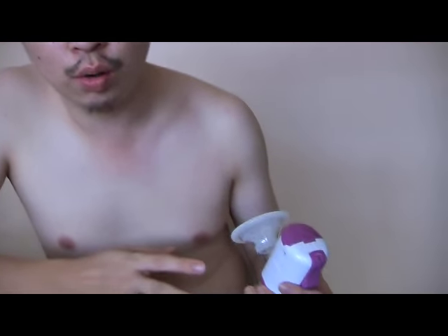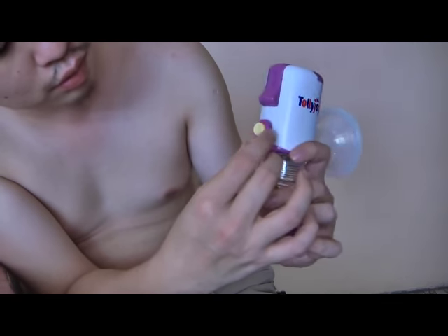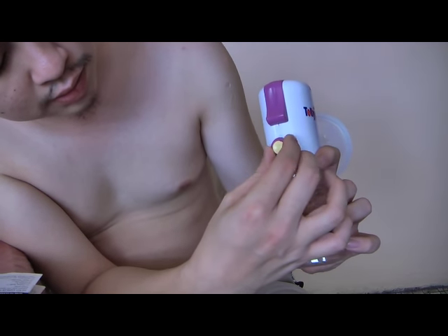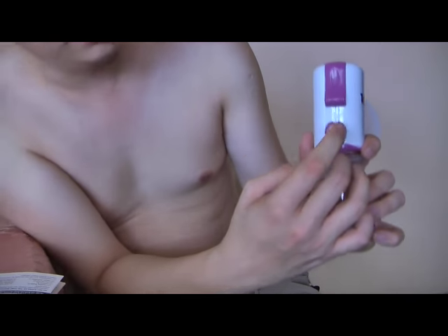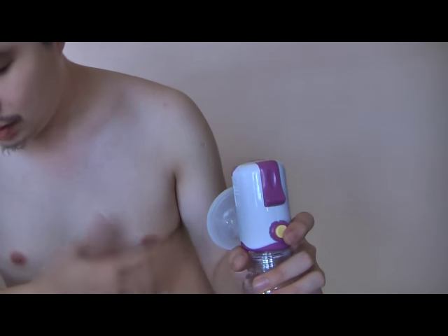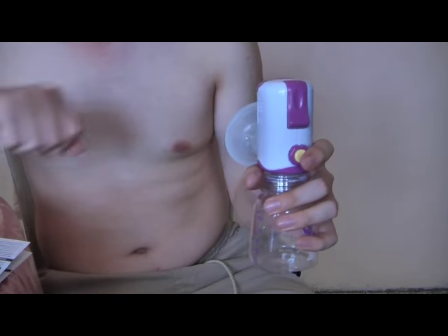Turn the suction control knob to the low setting, which is counterclockwise. L means lower, H means high. The press button is for you to release suction in the event that your breast or nipple gets too painful with the heavy suction from this machine.